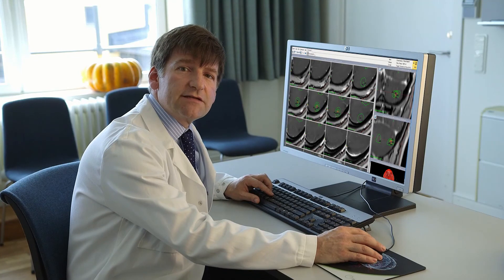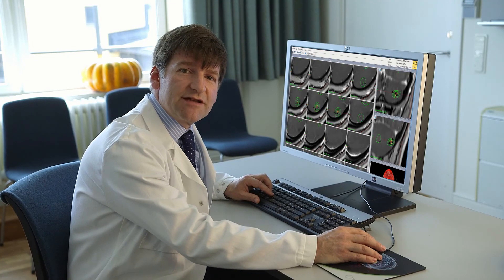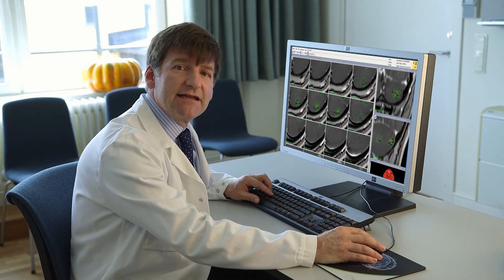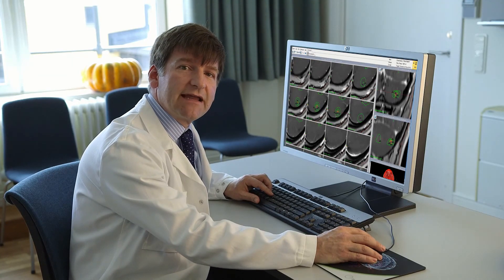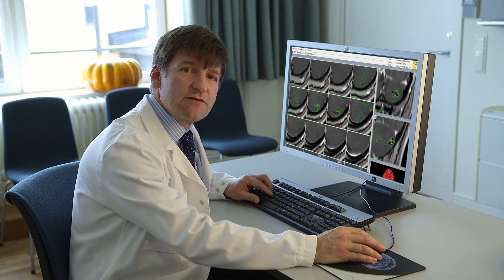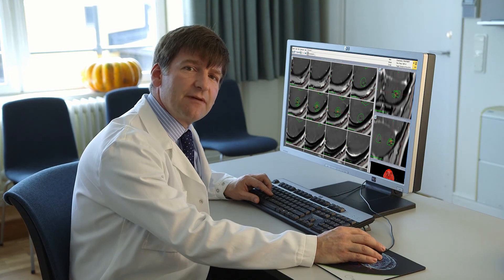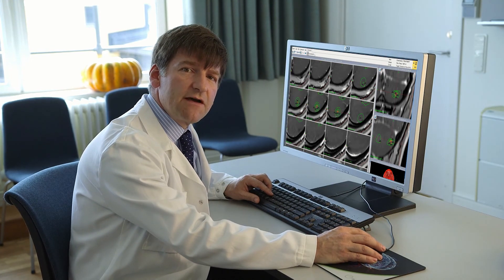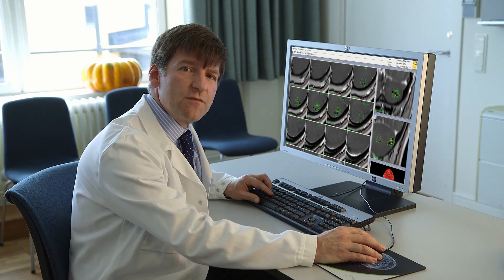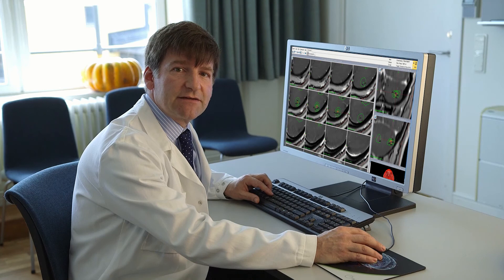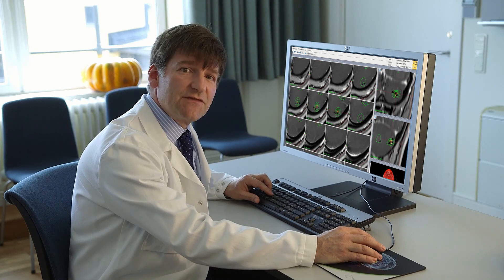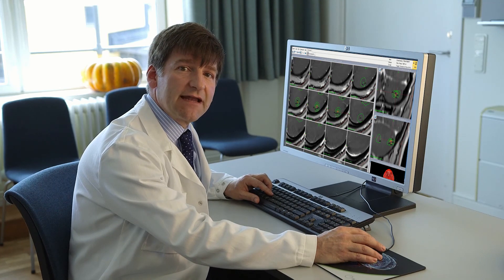To summarize, I've demonstrated how easy Lexel Gammaplan makes the treatment planning process, while producing plans of unrivaled conformity and dose gradient, in a fraction of the time that other planning systems would take.